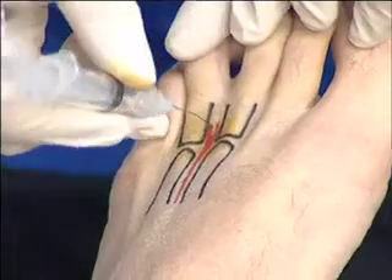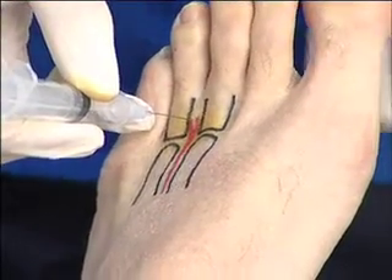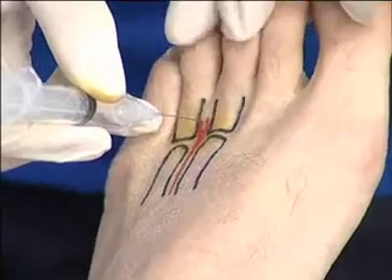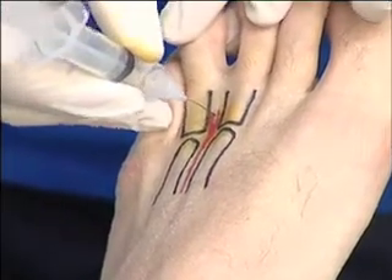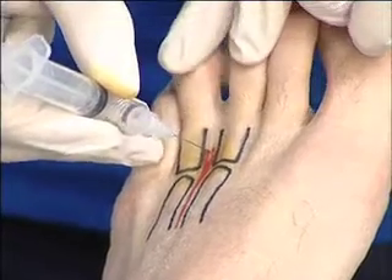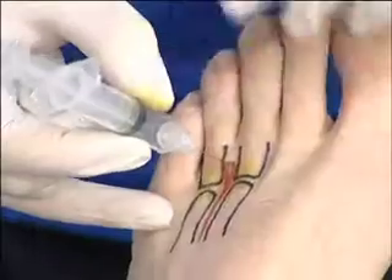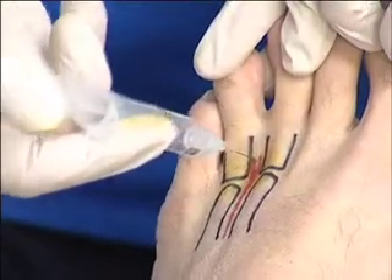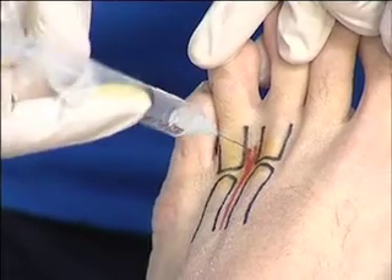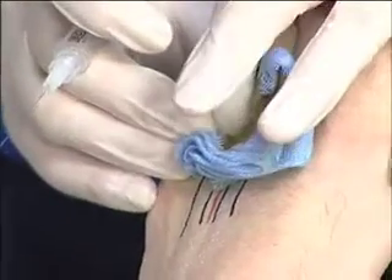Be aware that you're not coming through the plantar surface of the foot, and be aware that sometimes patients will feel the needle pricking on the underside of the skin, which is not necessarily where the neuroma is. Eventually it is worth taking the time to look around. The arteries are quite small, but you can aspirate. When you're in the right position, just inject — move the needle around just a little bit to get all the branches. Then withdraw, and apply pressure to keep the steroid from coming out of the needle hole.